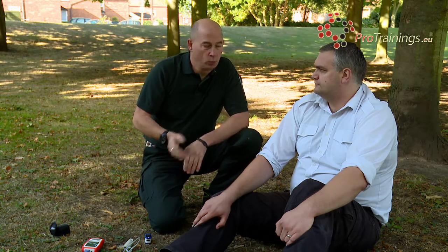So now we're going to have a closer look at pulse oximetry. Before we actually use pulse oximetry, we look at the patient themselves. What colour are they? Are they a nice pink colour? Are they blue? Are they cyanosed? Are they hypoxic? Are they using ancillary muscles to breathe?